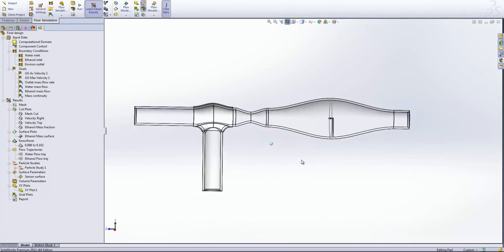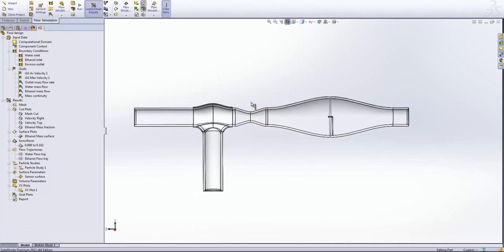In this case, what I've done is added a little pinch. So we've got exactly the same divergence in the pipe, but I've also added a little pinch which is going to accelerate the flow in that region and hopefully give it a bit more of a mixing action just prior to that divergence, which is still going to slow it down and reduce the flow speed and hence the force that's acting on our sensor. So now let's have a look at that.